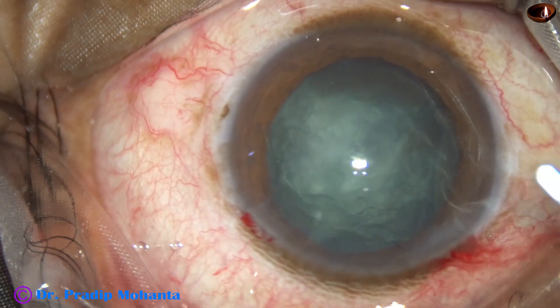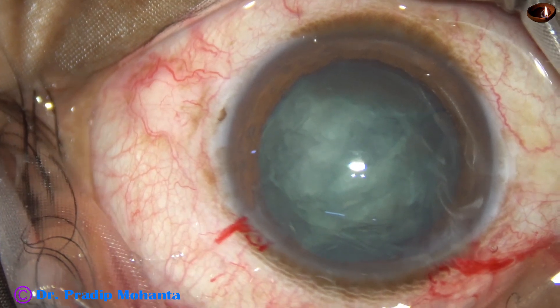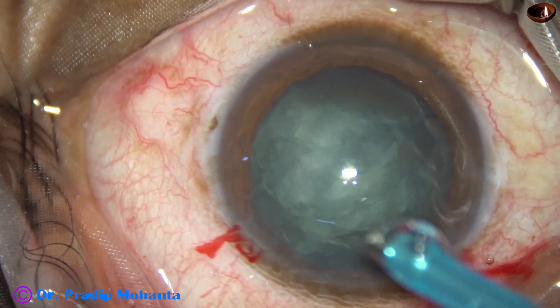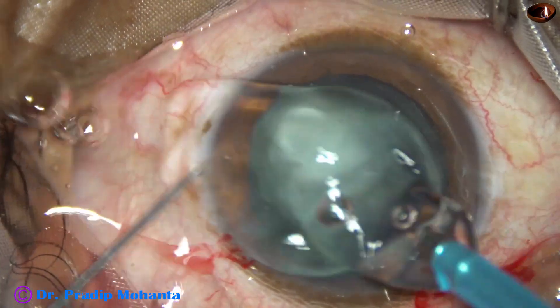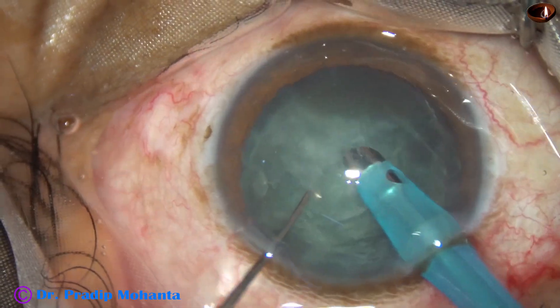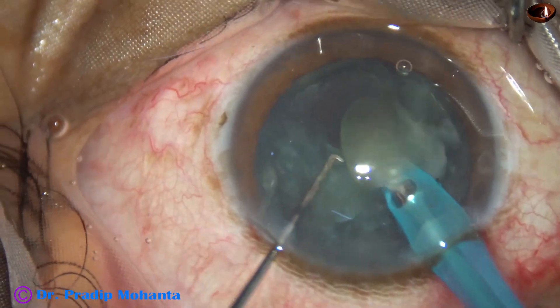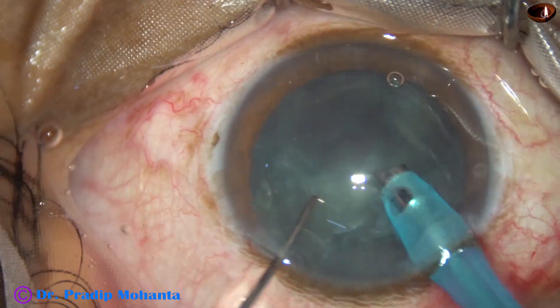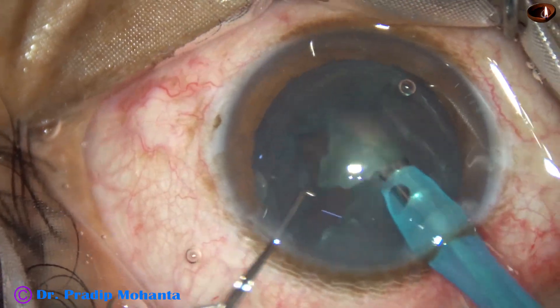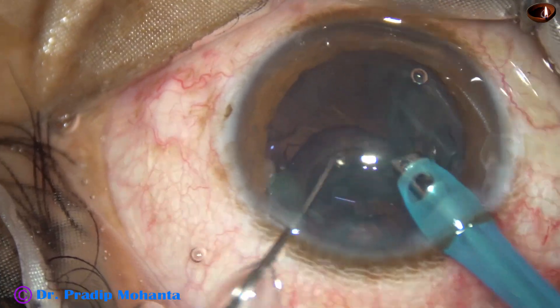Now it is time to introduce the phaco needle and remove the pieces. The phaco needle goes in with its bevel down. This is an Oertli Cataryst 3 phacoemulsification machine. Some superficial lens matter is removed, and then the free nuclear fragment is picked up and emulsified. This hemi-nucleus is easily chopped and emulsified.